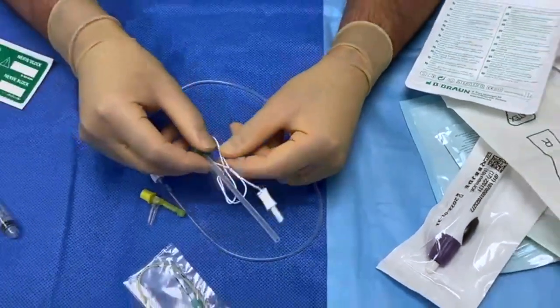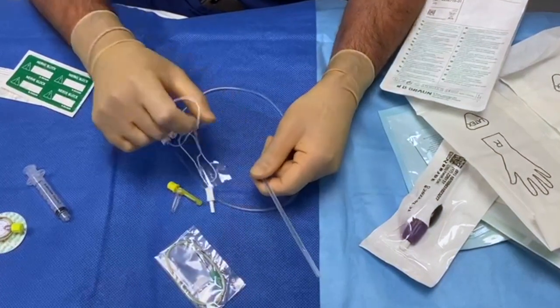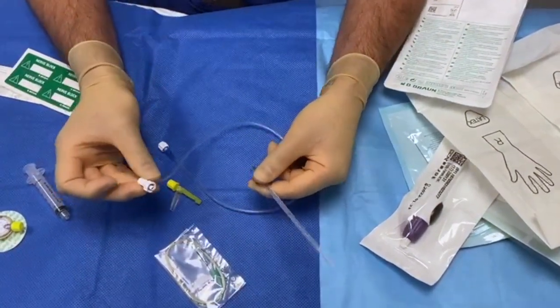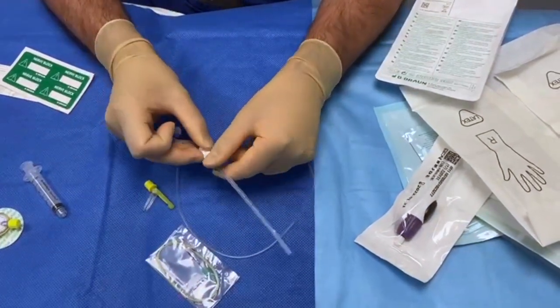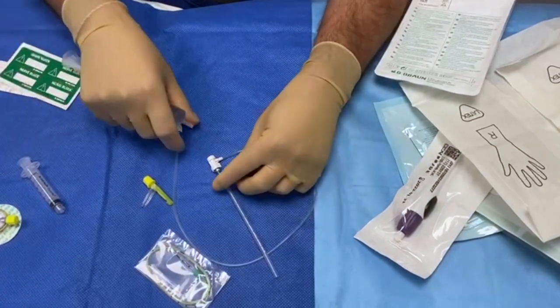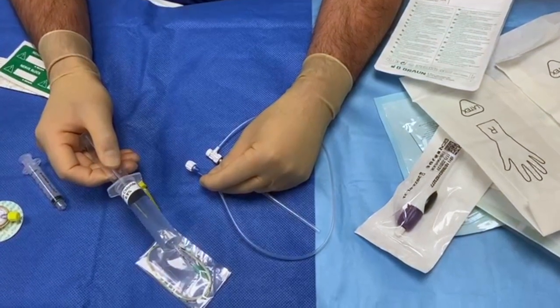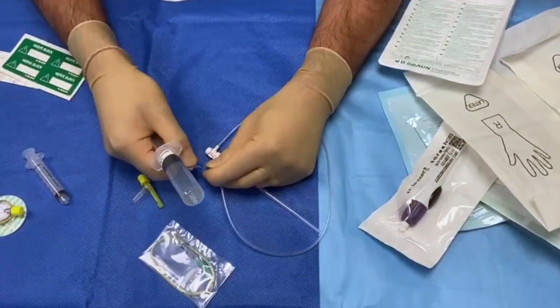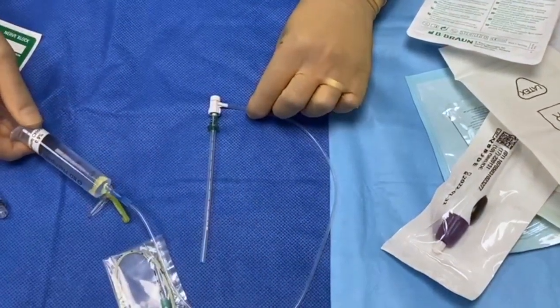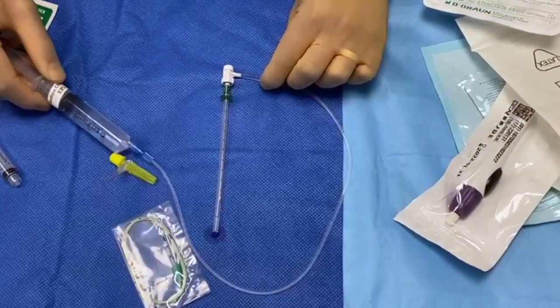The first thing I do is remove the electrical cabling because we're not going to be using this for this procedure, so I remove it to one side. I take the connection and connect it on with a nice twist — at the moment we have luer connections but that may well change in the future. I then take saline as a flushing solution, remove the cap, connect it, and purge the whole set with saline right the way through. You can see saline coming out the end of the needle.